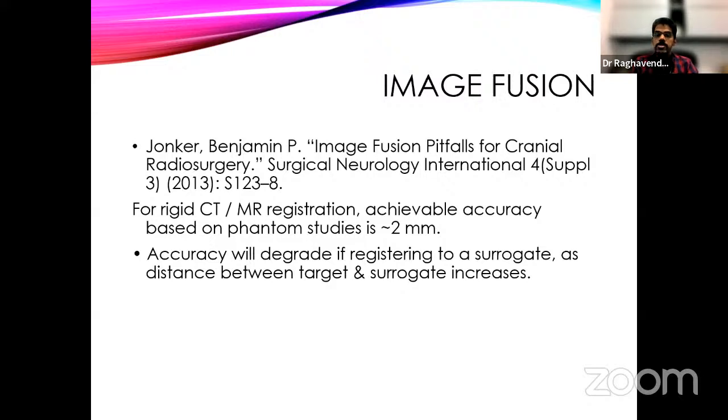This is what a neurosurgeon or a radiation oncologist will tell you. But be careful. You point this out to them. You know your isocenter accuracy, you know the achievable accuracy in CT, the achievable accuracy in MR, and the achievable accuracy in CT-MR registration, on which they are going to base the contouring. If you combine all of them, it cannot be zero. That means your CTV to PTV margin has to be there, even if it is an SRS program. That's what I wanted to stress.